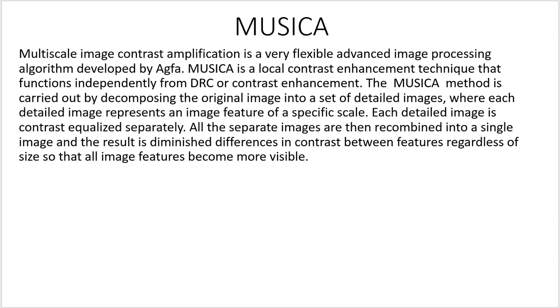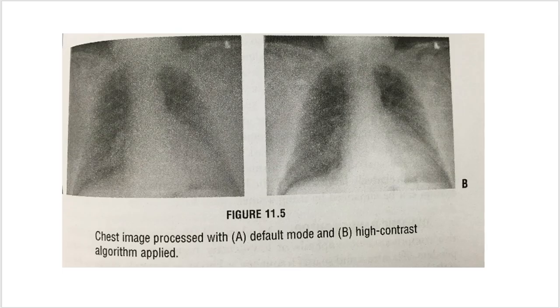What on earth did I just say? Holy cow. What I said was, in an image, let me scroll back to an image, they would take out, from this image that you can't see anyway, the bones, take out all the ribs, subtract them out of the image, and do contrast enhancement just on the ribs.